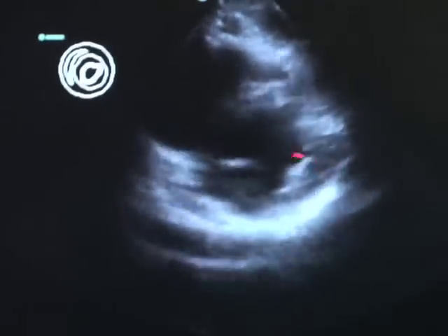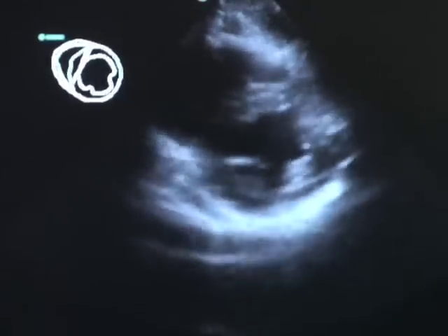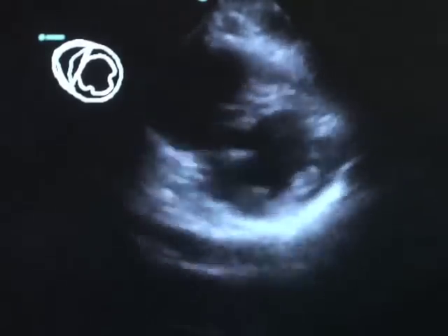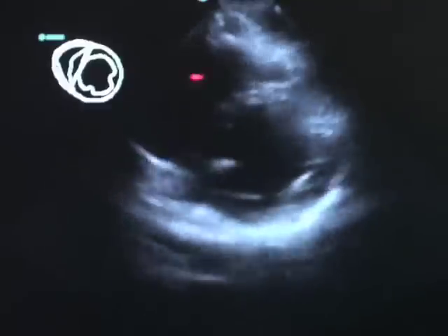As you're watching this image, you can put a mental finger in the middle of the left ventricle and see that all the walls are concentrically squeezing toward that. Then as she pivots the probe even more distal toward the apex, there are no landmarks within the circular-shaped left ventricle, and we are now at the apex.